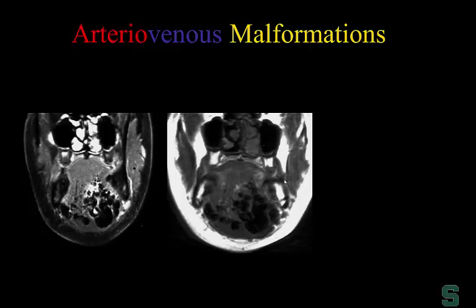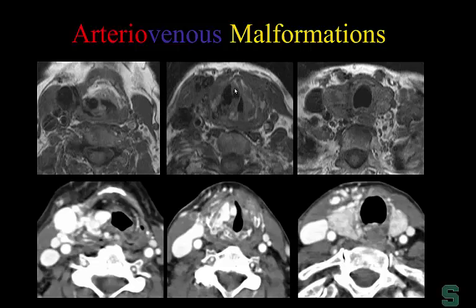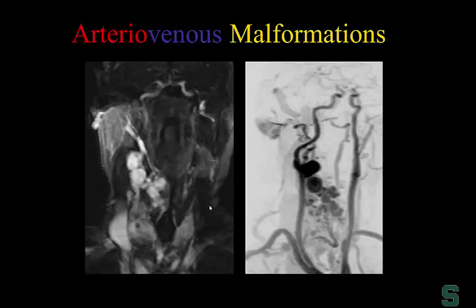Here's an example of an arteriovenous malformation involving the floor of the mouth and larynx. On non-contrast T1-weighted MR you can see flow voids; on CTA there is dense enhancement throughout; and on MRA there are diffuse enhancing lesions involving the larynx.